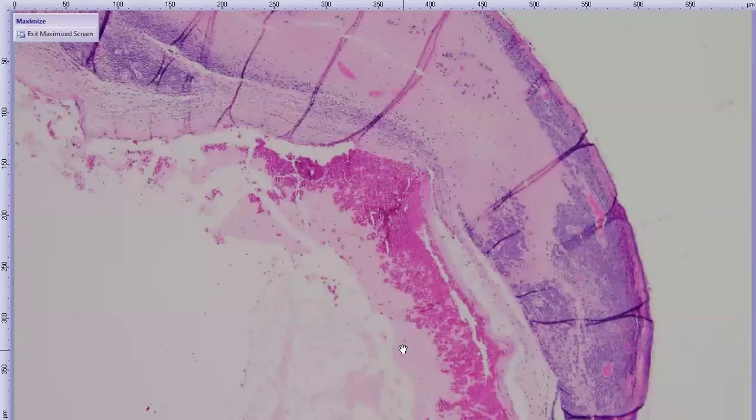And what really clinches it is looking at that cornea, which I saved for last because that's my favorite, saving the best thing for last. Makes total sense when you're doing pathology.